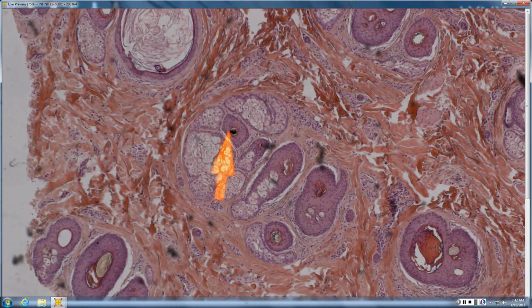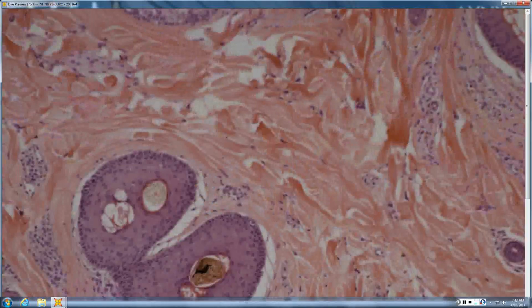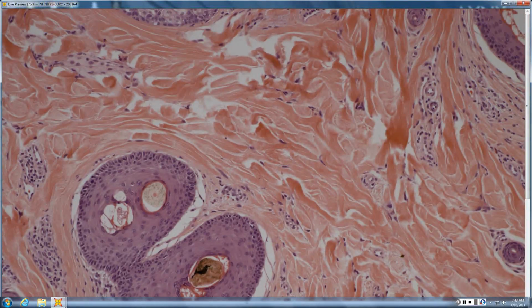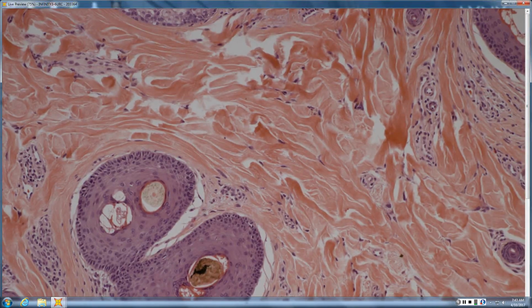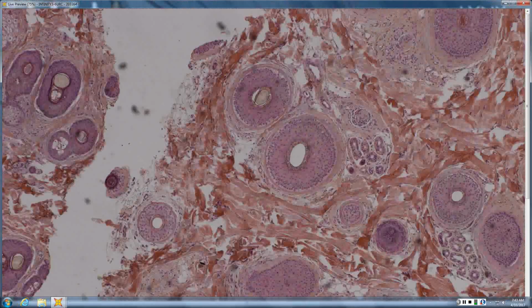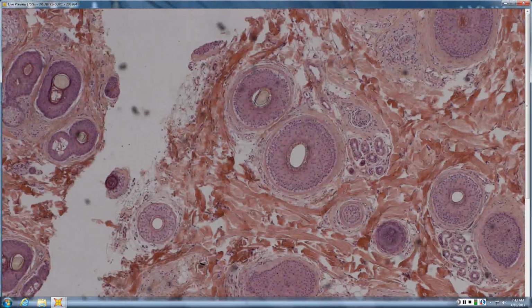Is that a fractured hair shaft? It's a little bit south. Down here? Yeah. It's more just keratin and pigment cast. Okay. But, you know, blood, I guess. Hamburger sign is where the hair shaft is broken in 2, so it looks like a hamburger bun with debris in the middle, which is the patty, and you can get hot dog signs and all kinds of things like that in trichotillomania. But all that weird keratin goes with trichotillomania too. You tend not to see it in the other 2.